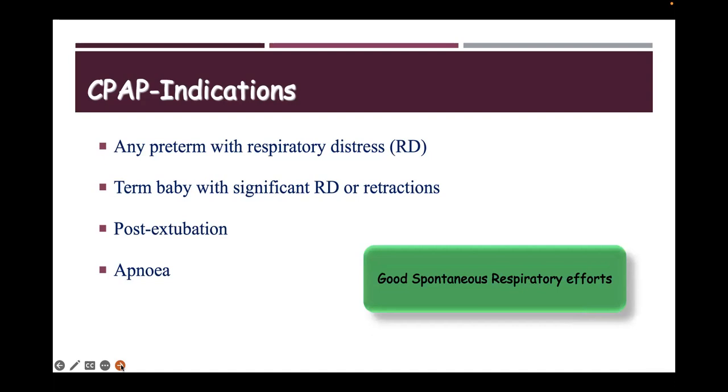However, one should always remember that for putting a baby on CPAP, or for that matter, any non-invasive respiratory support, baby should have good spontaneous respiratory efforts.